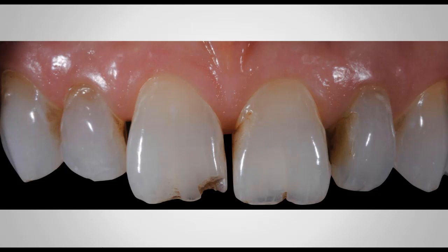preoperative photo of the case that I'm going to share with you today, and I'm going to go through the whole process, through the whole 9 yards of this case, all the way down to the final restorations, the final bonding of the veneer restoration that we're going to do 7 through 10 for this particular case.